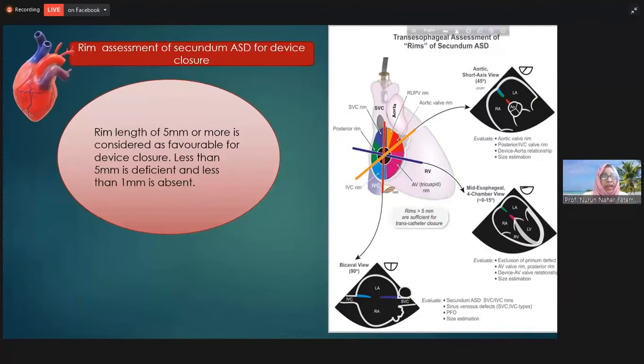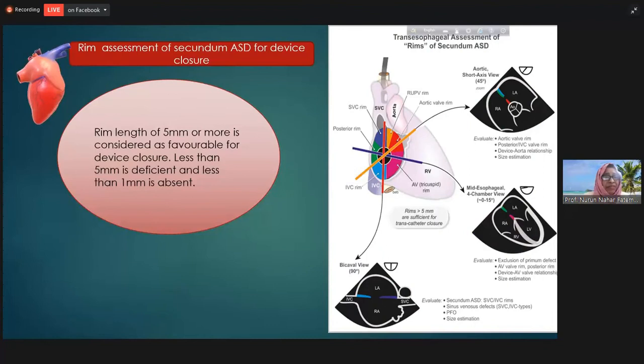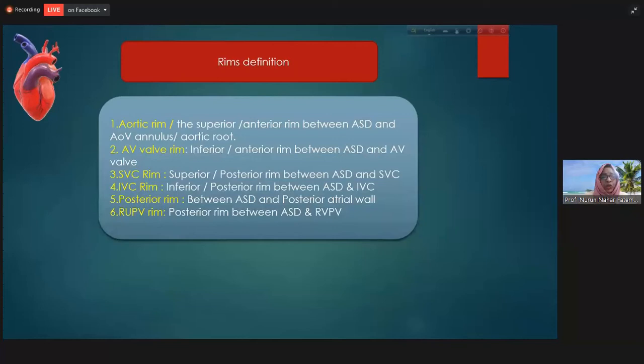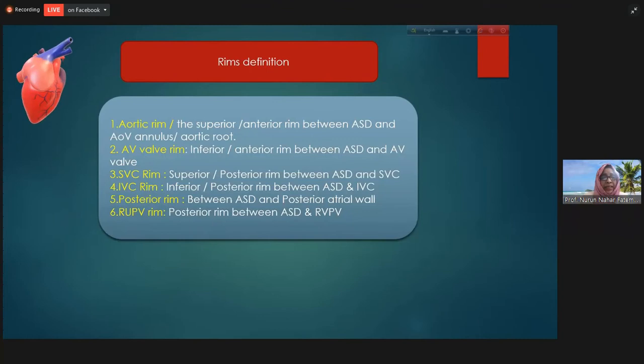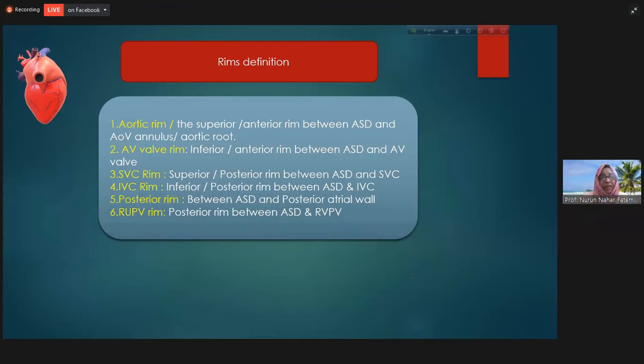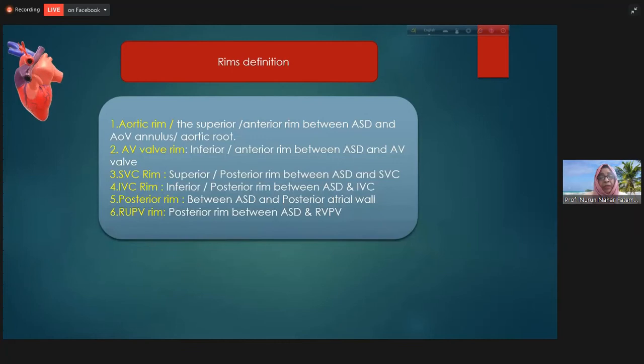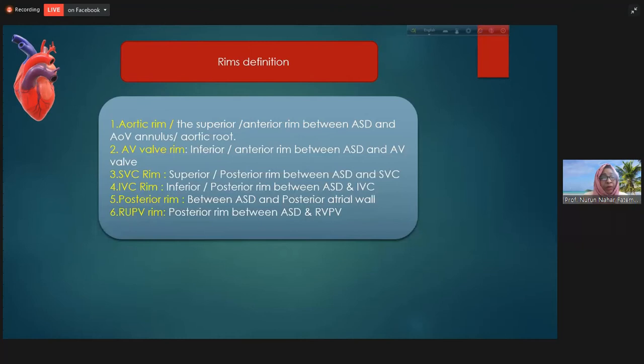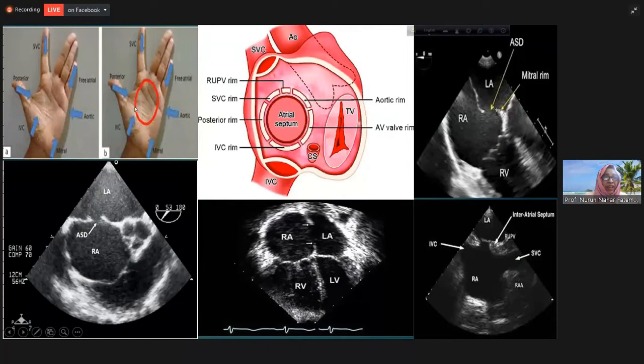Rim estimation is the most important part for device closure. If the rim is less than 5 mm, we call it deficient; if less than 1 mm, it is absent. There are various rims: the aortic rim (anterior superior, between atrial septum and aortic valve), the AV valve rim (between atrial septum and AV valve), the SVC rim (posterior superior, between ASD and superior vena cava), the IVC rim (between ASD and inferior vena cava), the posterior rim (posterior wall of the atrium), and the right upper pulmonary vein rim (between ASD and right upper pulmonary vein).